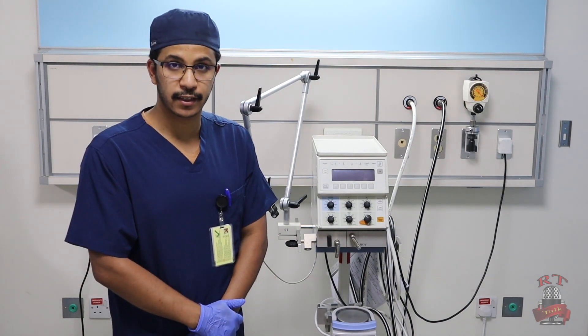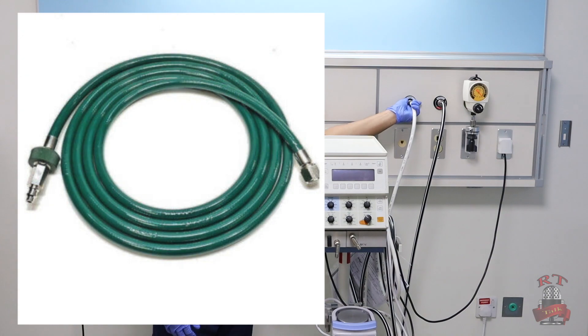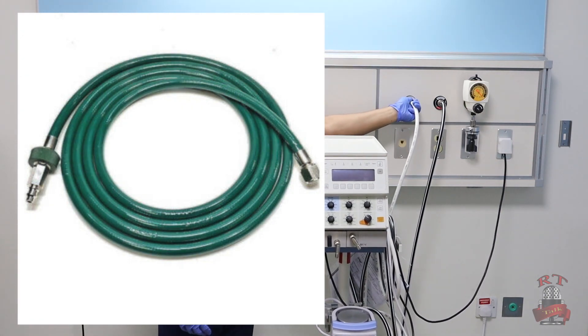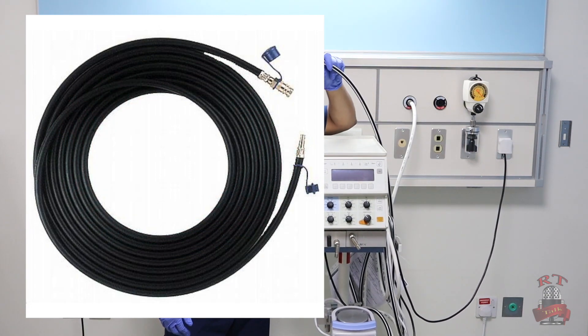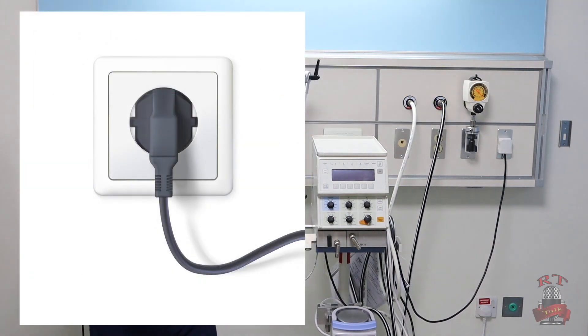First you will connect your oxygen line. After this, you will connect also your medical air line. Then you will go to your ventilator and plug in the electricity for your Babylog and also for your humidifier.